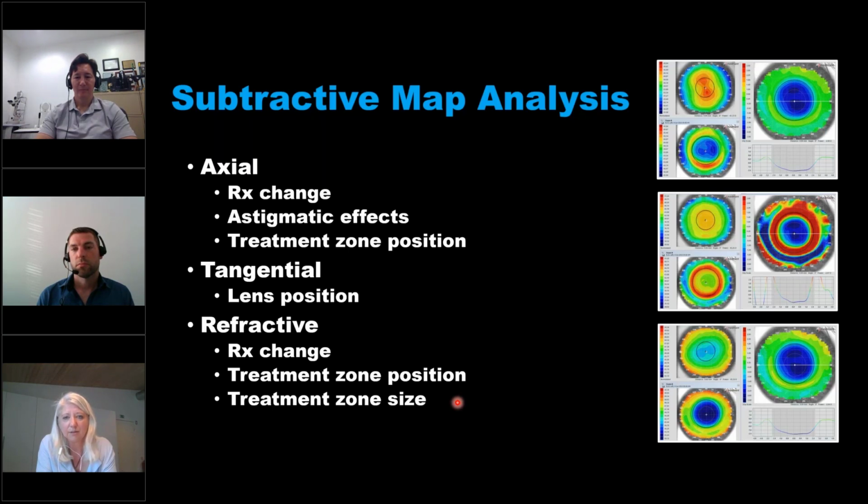Because if it doesn't, if we only have like 2 half circles, we might not create this, let's say, vacuum that we want under the lens to create the stability of the myopia management. So yeah, thank you for that perspective. I think you guys are right. We could use all three, and for that listener that felt that the refractive has value, you're absolutely right. You don't need to drop it from your repertoire of analyses.